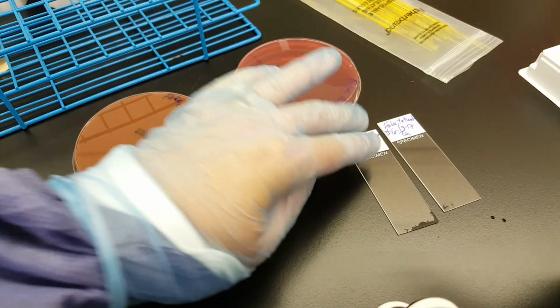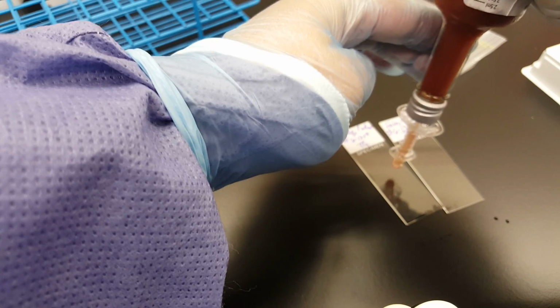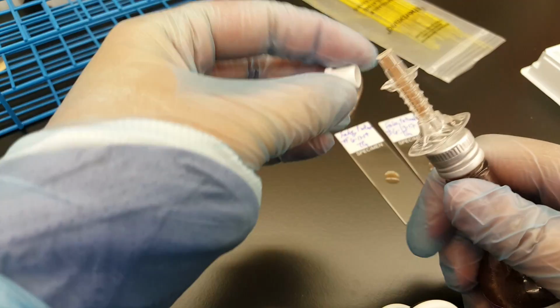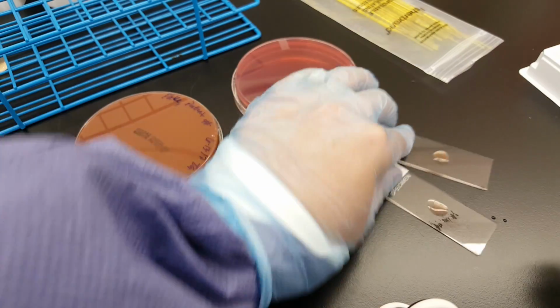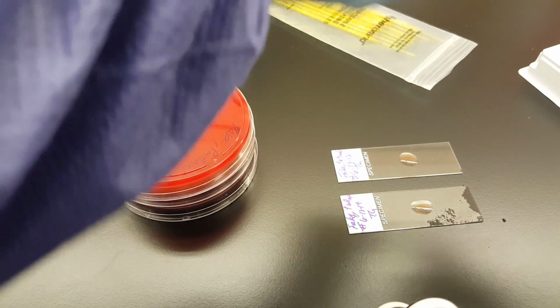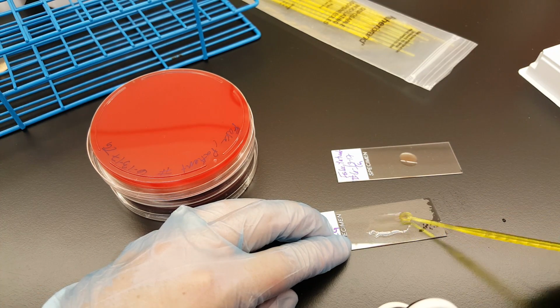You could do both of them first. It just so happened that I forgot when I was demonstrating. So there we go. You can put the cap back on so that it doesn't go squirting anywhere. And if you had done this with the rest of the plates, you would have streaked it out with that original loop. So you can move it around.